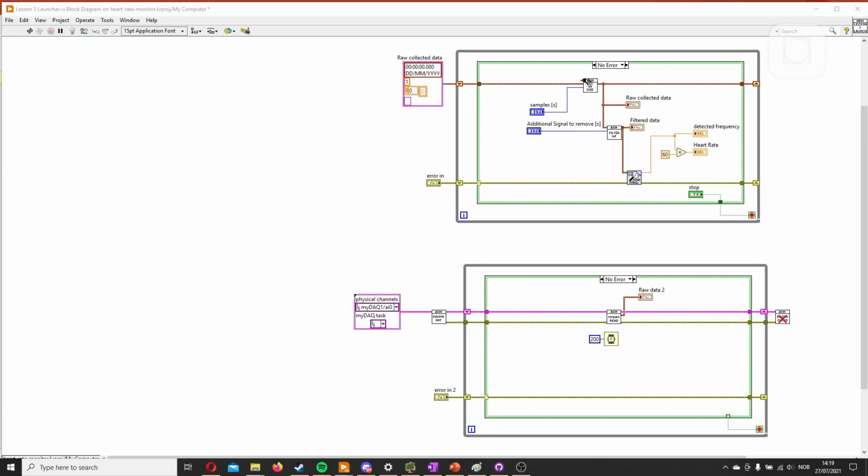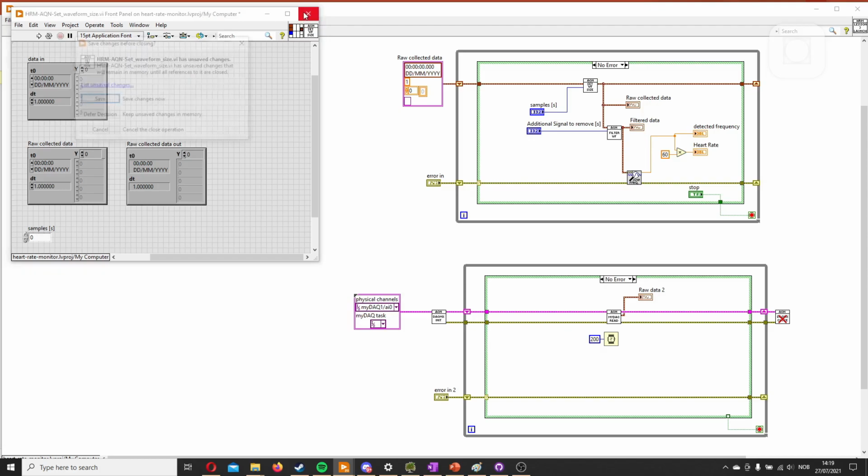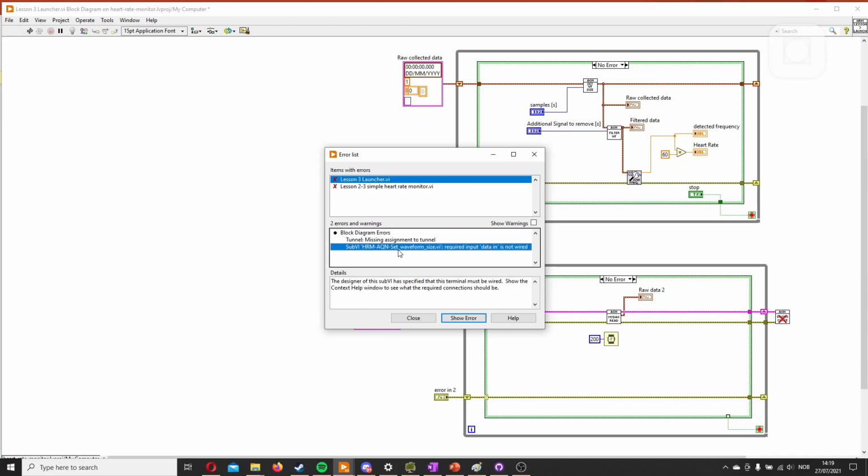What we also need, which there's no error for, is an input here. What we can do is say that this connection is required because, frankly, it is, because this VI without the new data input is useless. So we'll add this. Now, by saying that this is required, it also complains about this one and cannot run before we have an input there. This is good because then it will tell you what you're missing when you try to run an application, and it will save you time in debugging.